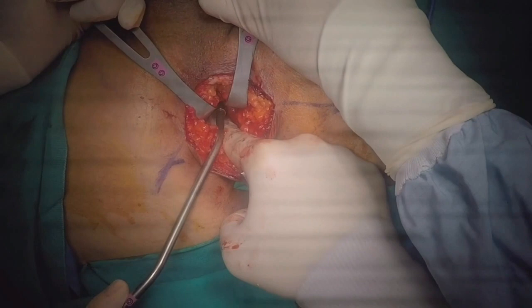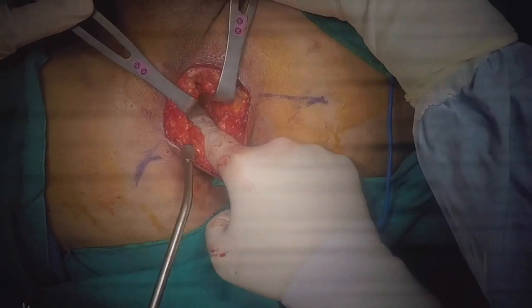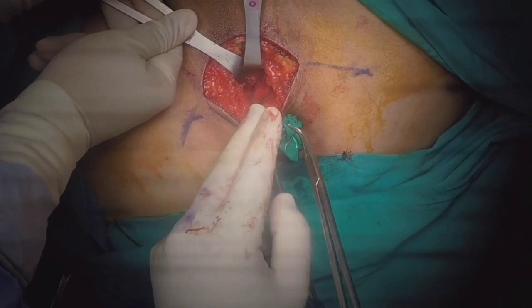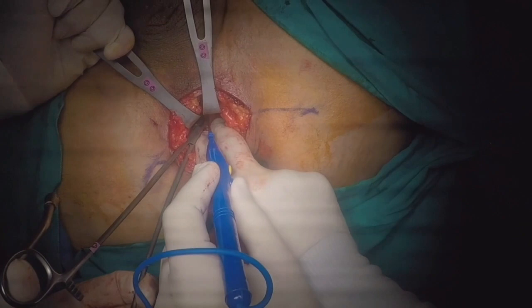So we must be careful. Have you ever had a rectal injury? Only one case. Yes, I mean probably one case, because my fellow. No. In the beginning of the learning curve, those things happen. And the patient was also on dialysis, kidney chronic disease. Tissue isn't good. Now, we will divide the rectourethral bundles.